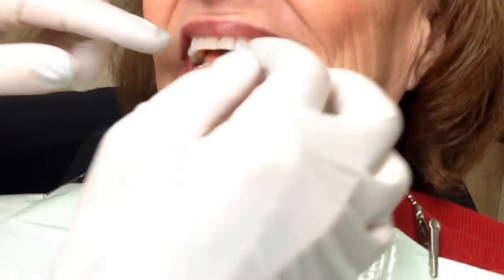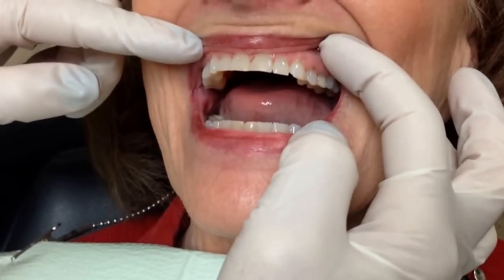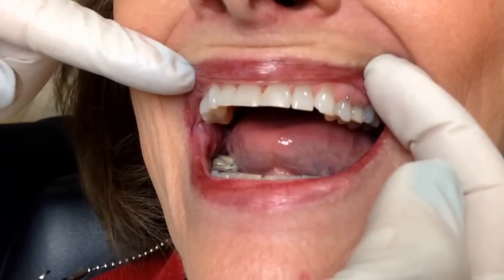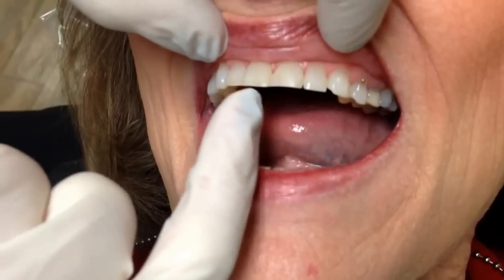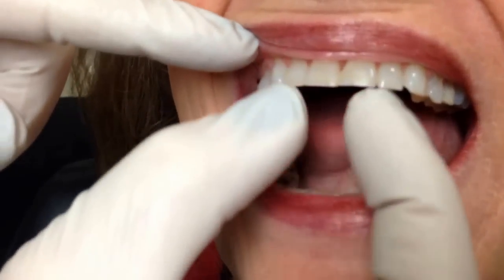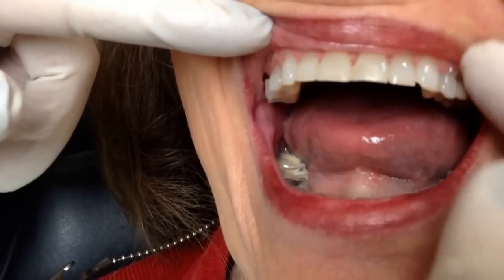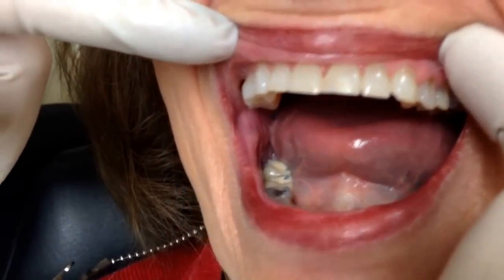Let's zoom in and look at the patient's existing teeth. Now, I know you guys out there in YouTube land are going to go, oh, but her teeth are perfect. Well, her teeth are really straight, but if you notice, all her teeth are the same length. In a cosmetic dental world, you want your two centrals a little bit longer than your two laterals, and then your cuspids — your eye teeth — are actually going to be longer than your two laterals. So all of her teeth look the same size because of age; they wear down.